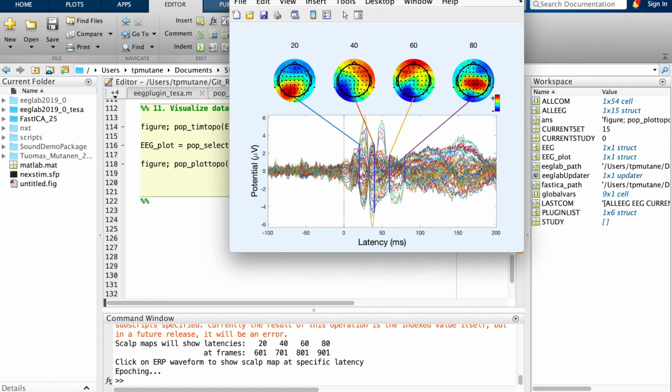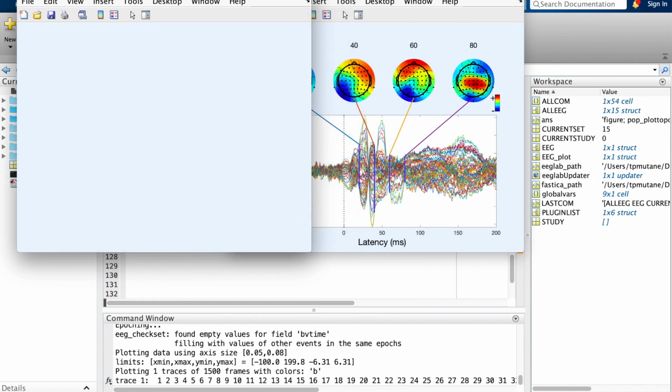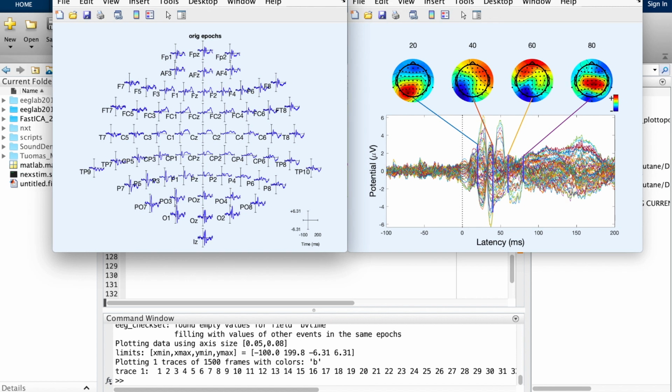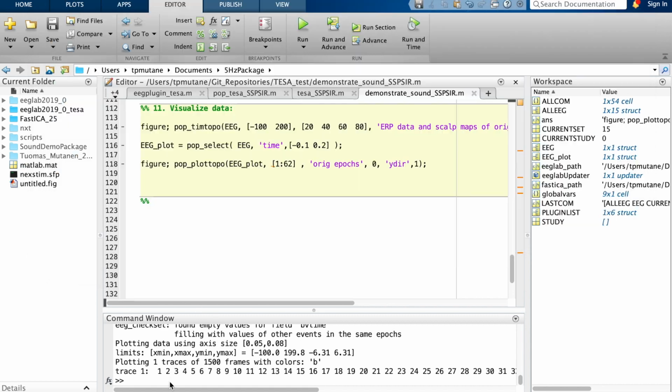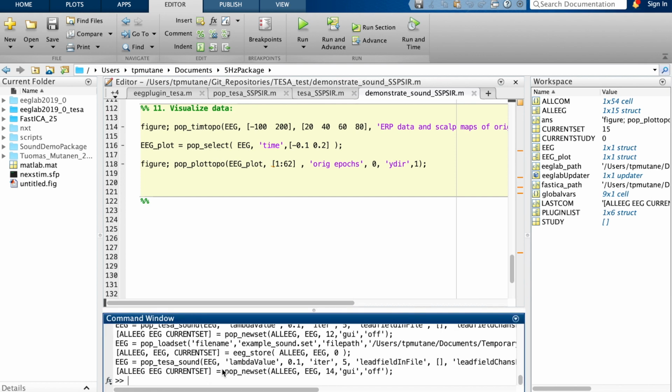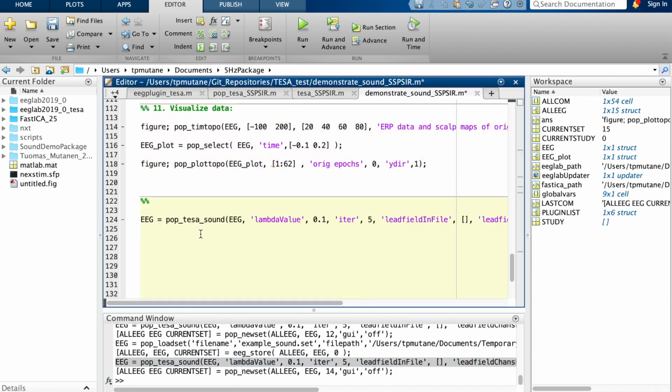And quite clearly, the neuronal signals which were underlying have stayed intact. We have some nice responses that could definitely be coming from the occipital cortex, which was being stimulated here, but we got rid of the bad channels. And again, we use the graphical user interface, but you can get the code by writing the EEGLAB history. And next time you can clean the data in exactly the same way by adding this command to your script.